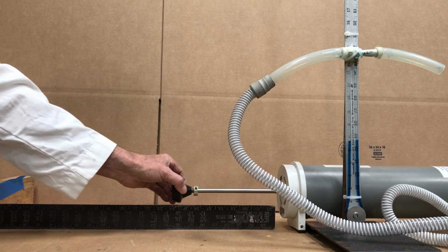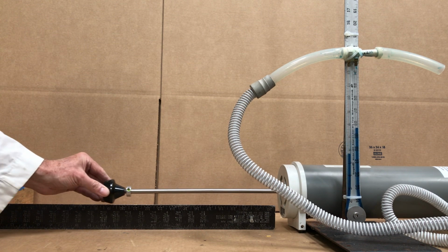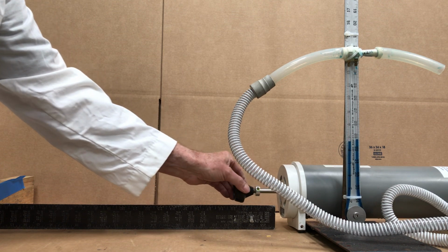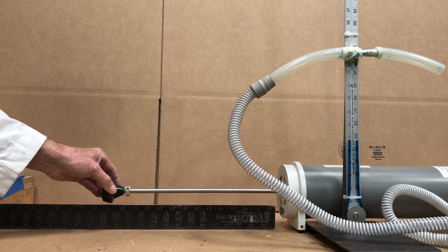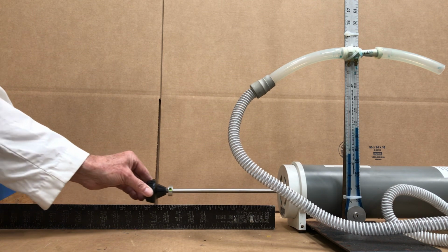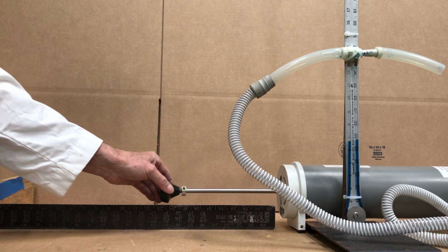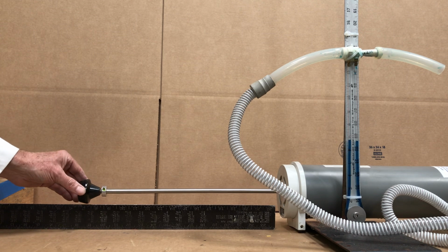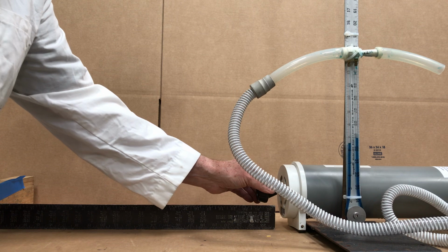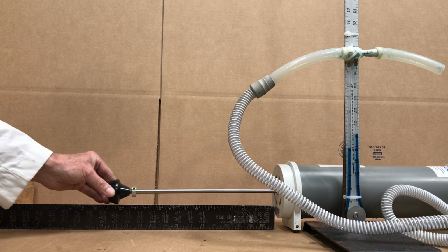But what we should be able to do is use the simulation of the U-tube manometer along with the simulation of the Venturi and some decent image processing to calculate how much air is breathing out of a patient's lungs or into a patient's lungs. Because the more air that goes into and out of the patient, the more they're likely to survive. So the respiratory therapist needs this data to understand if the patient is getting better or not.